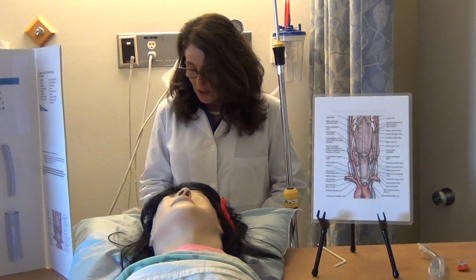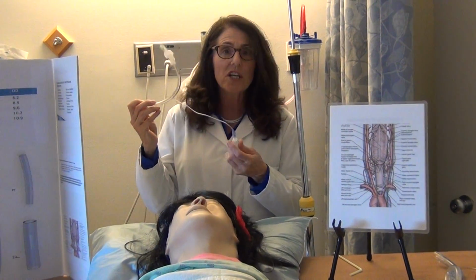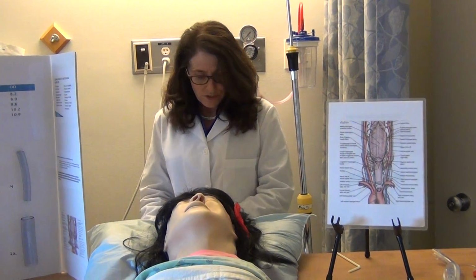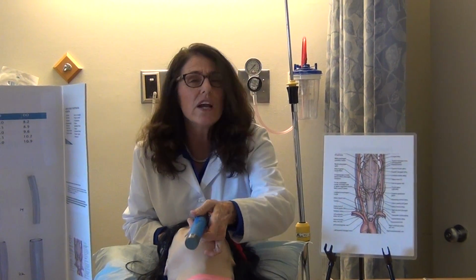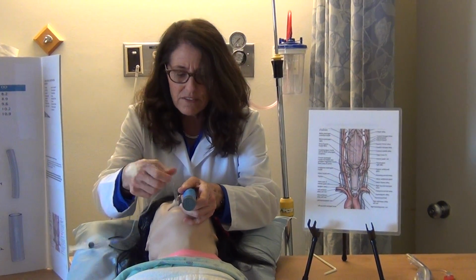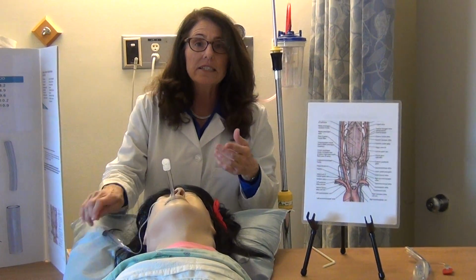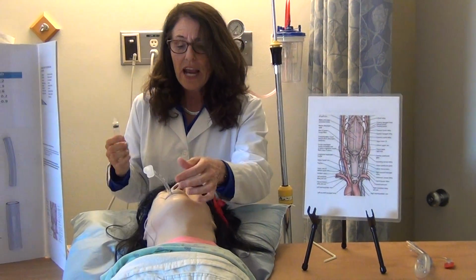So routine care is to use a size 7 for a regular size female and the injection and palpation technique to inflate the cuff of the endotracheal tube. So what you do is you use a laryngoscopy, and everything is very gentle during an intubation. And I insert a size 7 endotracheal tube into the patient's trachea. And then what I do, I take a 10 cc syringe, and so here, let's say I'll put about 8 cc's of air in.